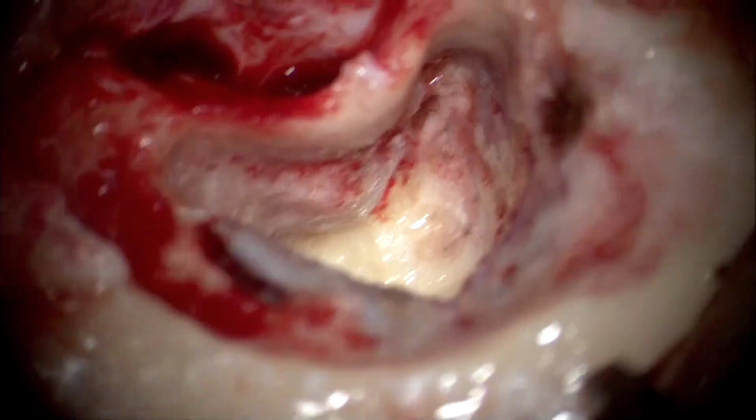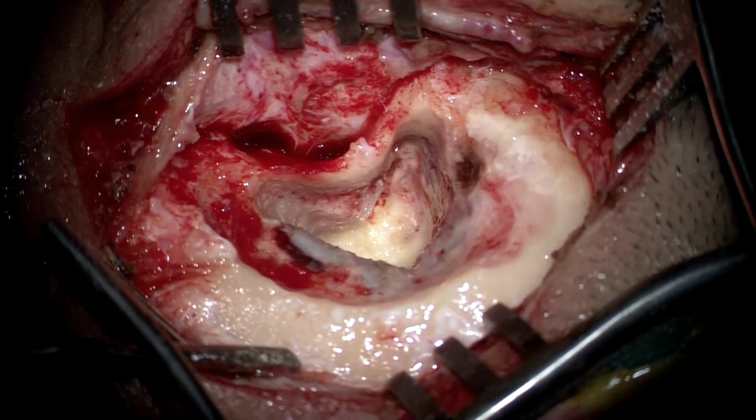And this concludes our transmastoid labyrinthectomy procedure.